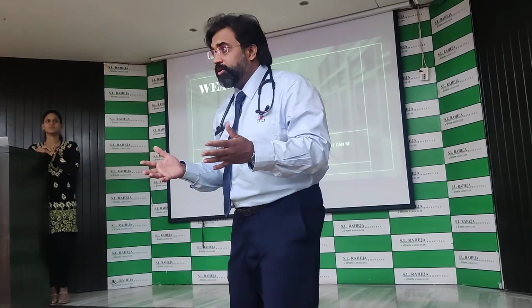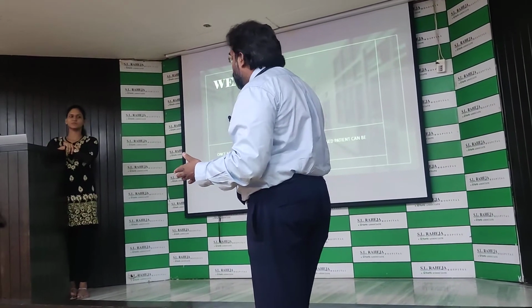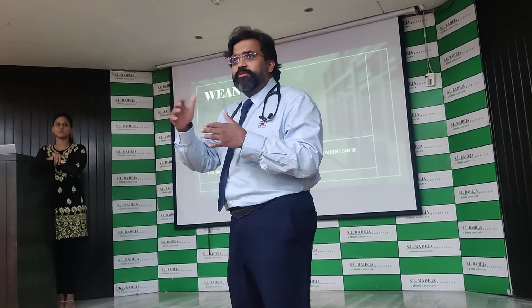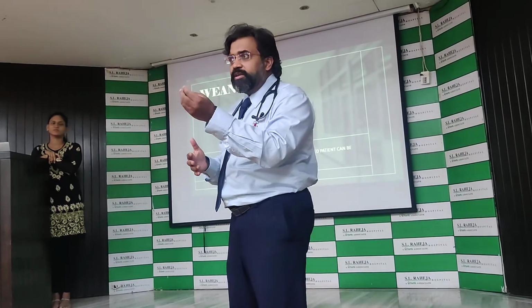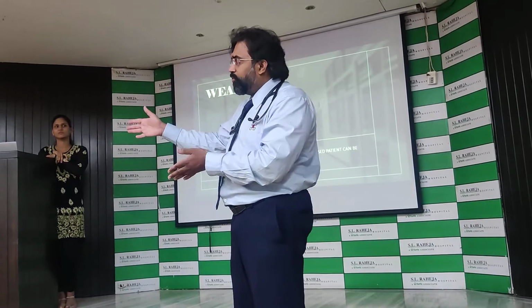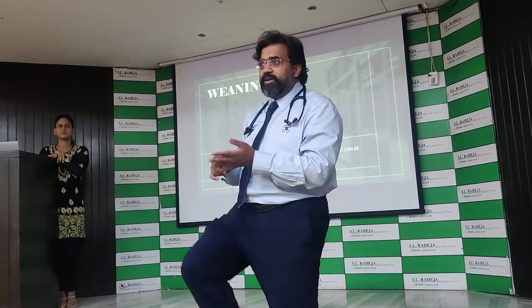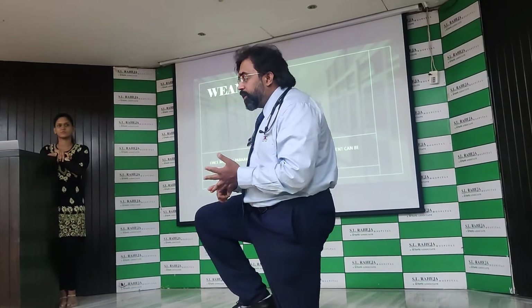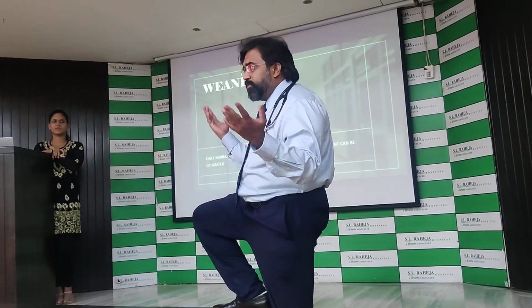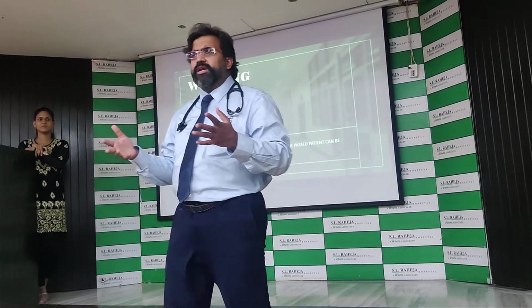Otherwise, it's asynchrony. Say you're in volume control and this patient starts breathing, what is going to happen? Every breath will be assisted with the full volume. So if the patient is breathing at 10, you will get 10 breaths. If he breathes at 20, you will get 20 full breaths on assist control. So his minute ventilation will go up, his volumes will go up. He will on the whole become asynchronous. His diaphragm is in a different league, his neural respiratory drive is in a different league, so a number of asynchronies would start coming in.